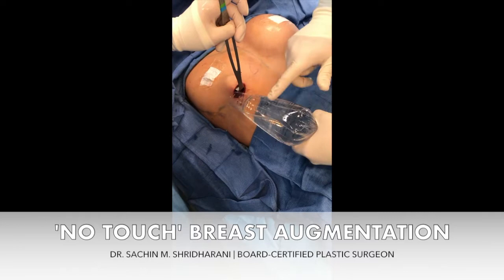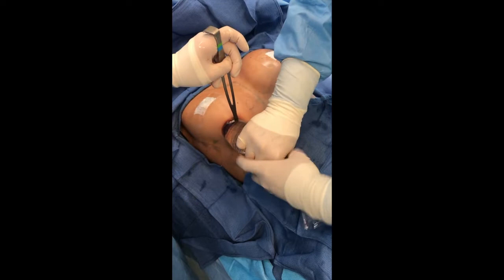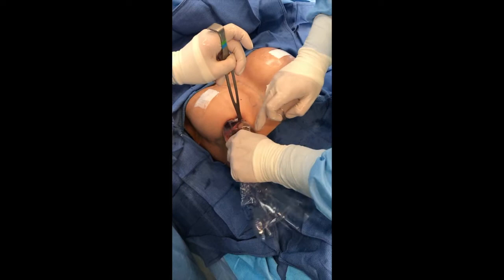Here we are, the next case of the day. We're using our Keller funnel with a no-touch technique to get a sizable, near 500cc implant into our patient. We're placing the sterile part in and working on getting our implant in — you can see it just goes in with relative ease without touching the skin, which decreases our risk of surface infections.